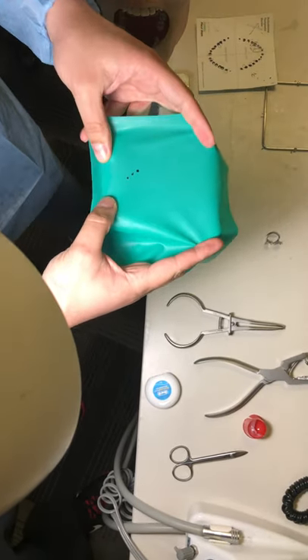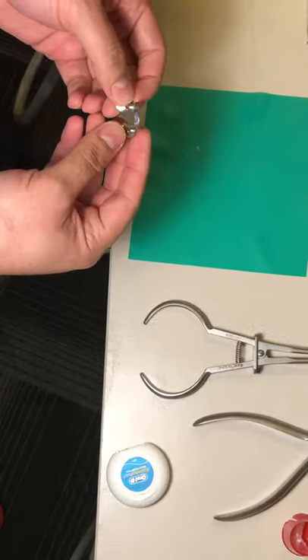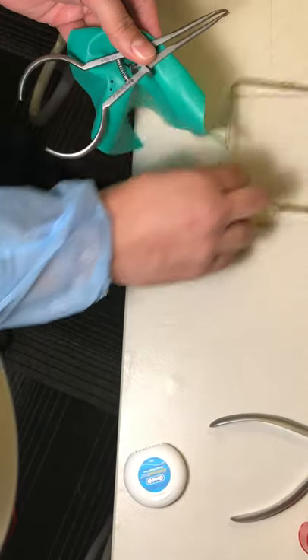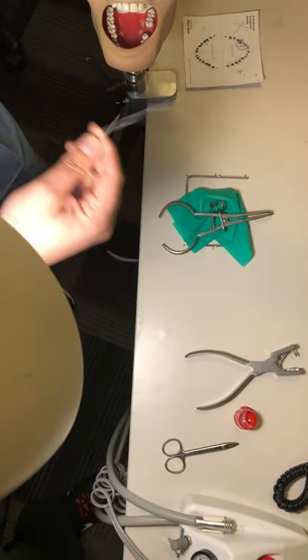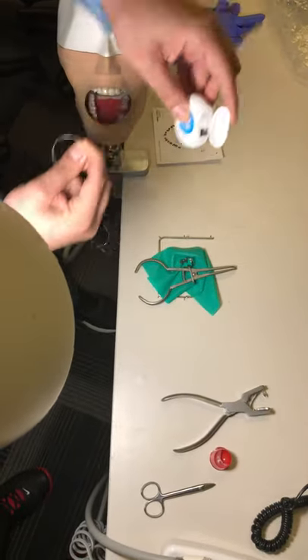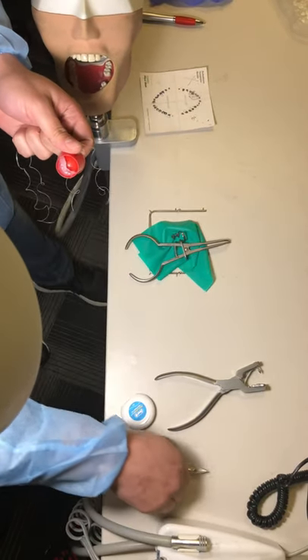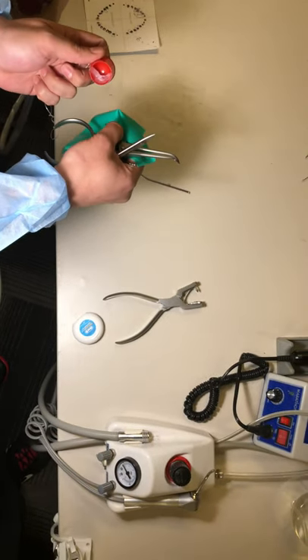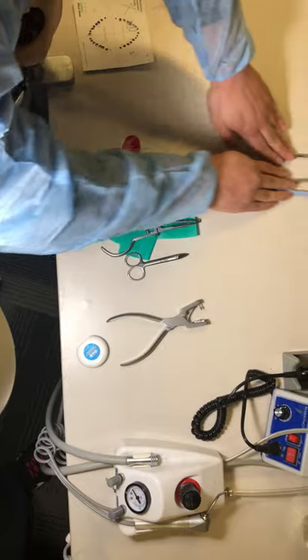We choose the clamp we need — or we can choose multiple clamps — and take them together with the clamp holder and frame. We take a large piece of floss like this, with some Vaseline on a cotton or in a dish, along with scissors. We take everything together and drop it on the bracket table, which will be the dirty area.